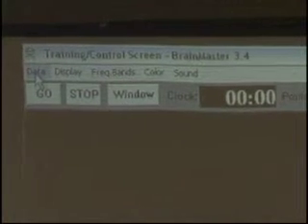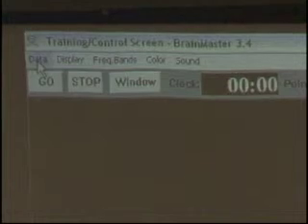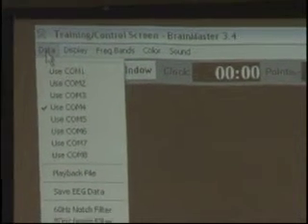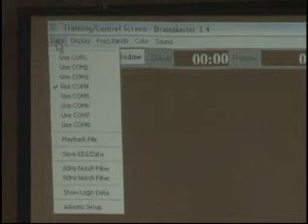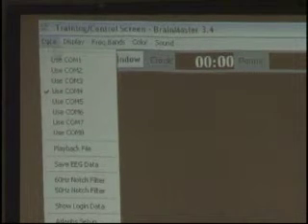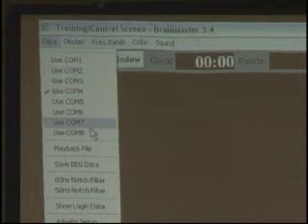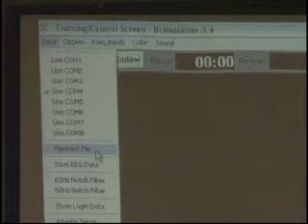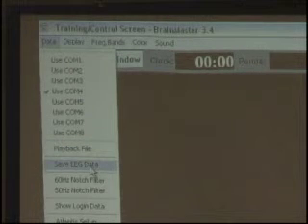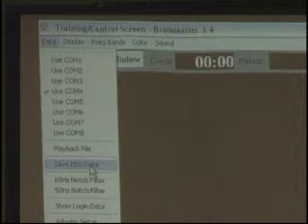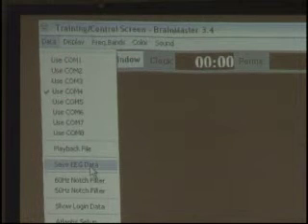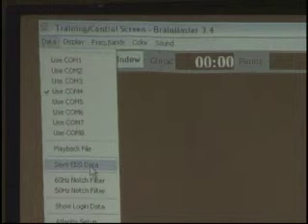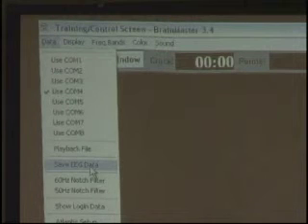On the Training Control Screen we see a menu bar along the top. Starting at 'Data,' I notice things similar to what we saw in data channels — I can choose a COM port number from 1 to 8. We also see 'Playback File,' which we remember from session control. Under 'Save,' we see 'Save EEG Data' — this is where during a session you can go to Data, click Save EEG, and it begins recording the raw EEG.